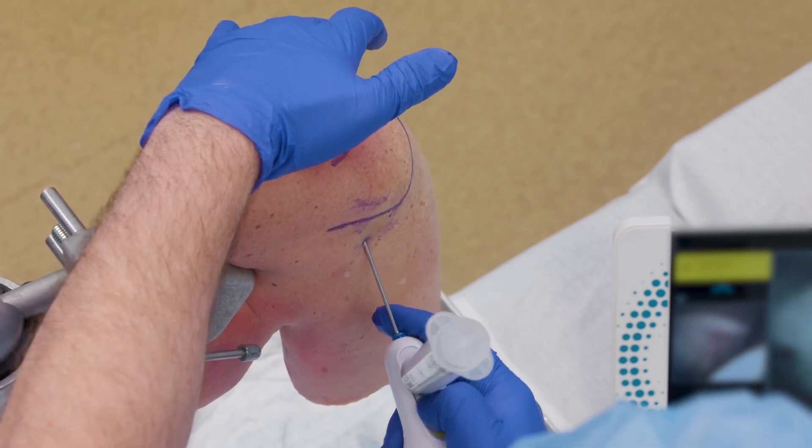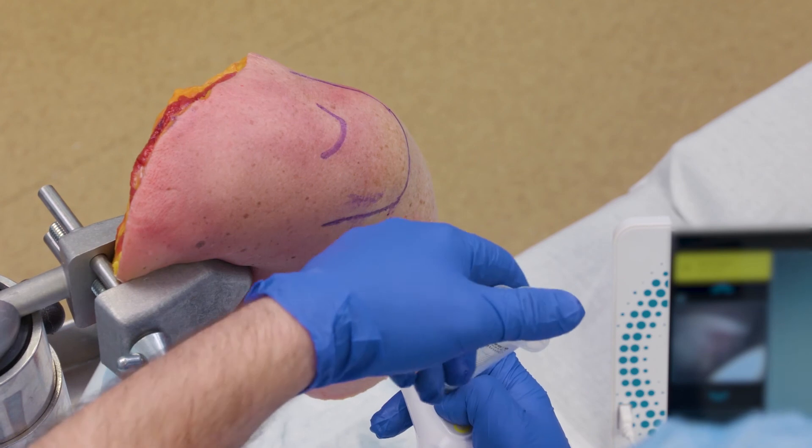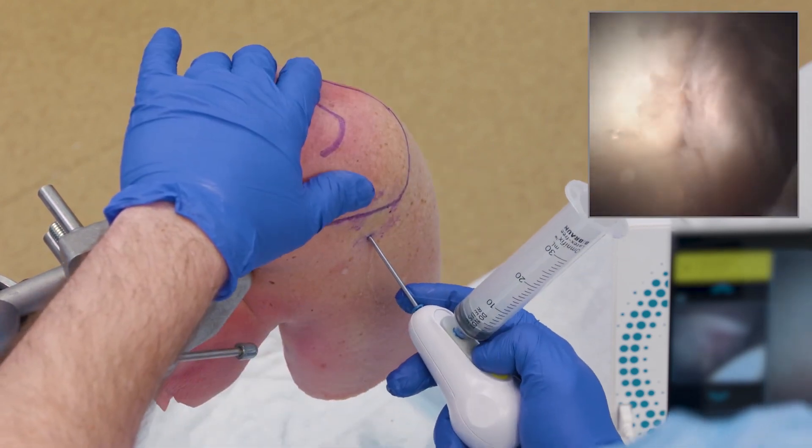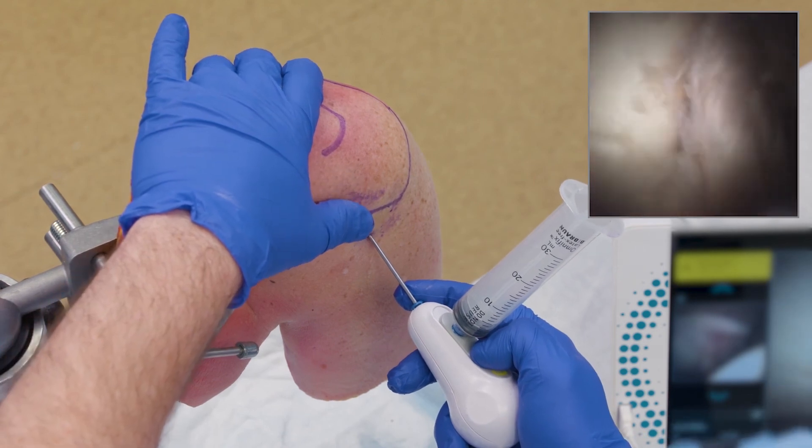I'll come up here and choke up a little bit so my finger's on the shaft, and gently push through my tissue into the joint. When I feel that pop, I'll retract my optics. If there's any soft tissue engaged on the end of my light source, I can flush it out of the way. Once you're in, you're able to get to that spot.